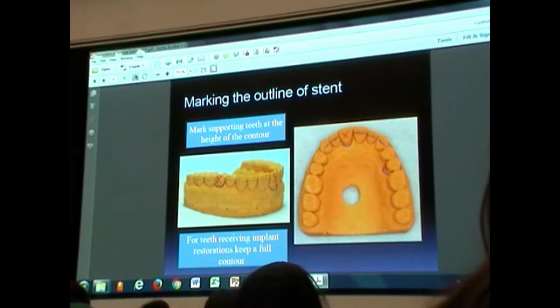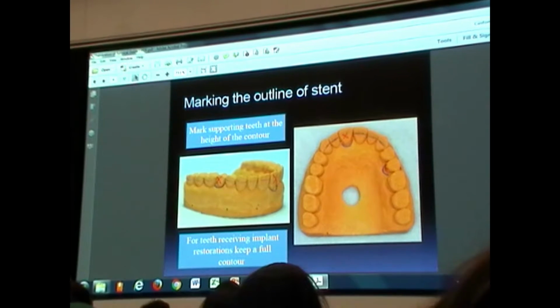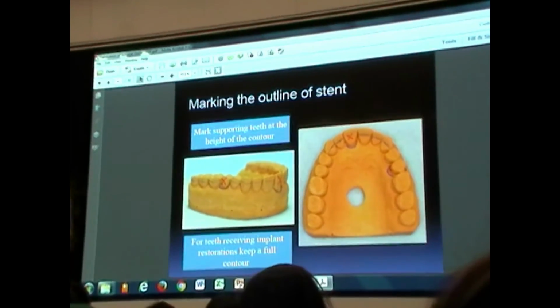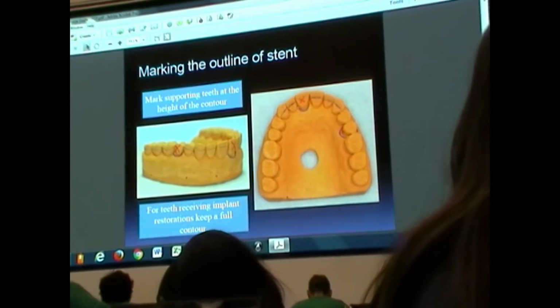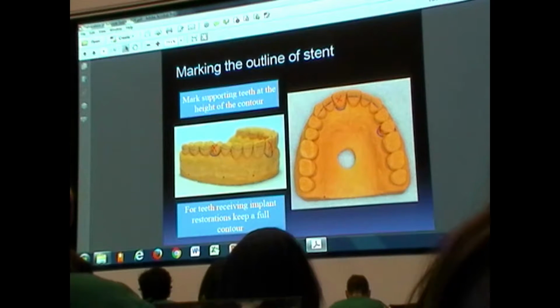So then we don't have to go through all of this of cutting, removing where the X is. Okay? The X is the tooth, and in our case, we're only doing 2. And I believe we're doing it number, refresh my memory, 9, or is it 8? 9 and 13? Like there. You have no idea. Okay. One of the codes is 29. Nope, this would be the maxillary arch. That's 4, 5, and 9.